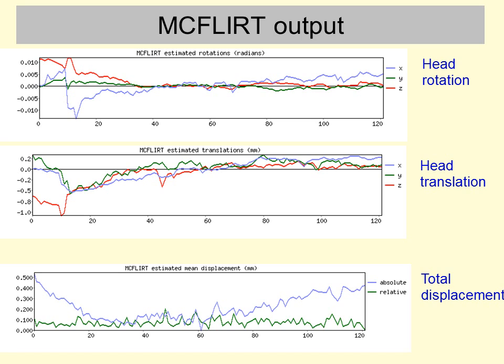And the reason it turns out like this on the graph is because these are absolute plots. So for say image 20 here, the actual 3 values are the absolute difference between the position of the image that was acquired here and the one that was acquired in the reference image.